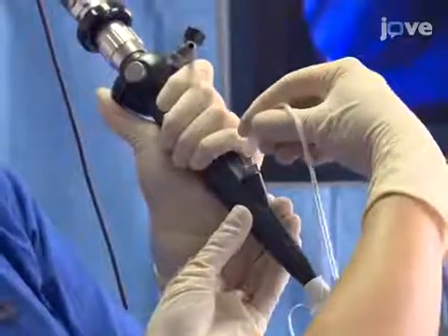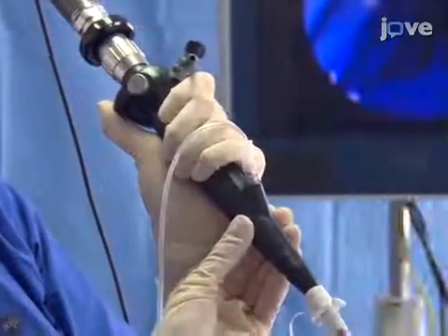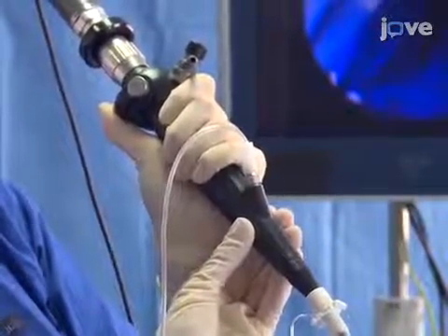Next, attach the connecting tube from the atomizer to the luer tap on the working channel of the endoscope. Then set the oxygen flow rate to 10 liters per minute.